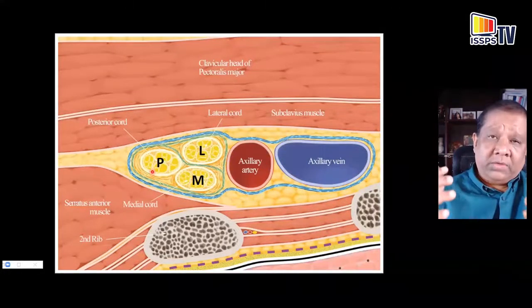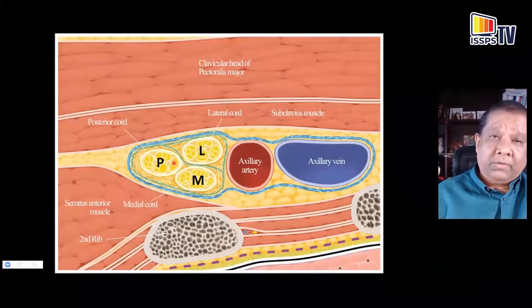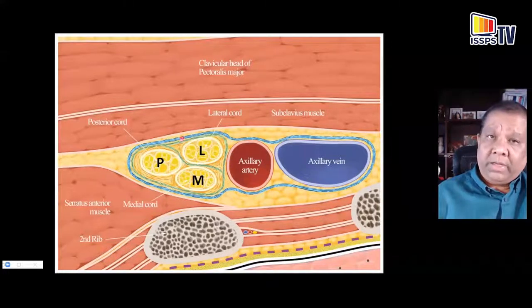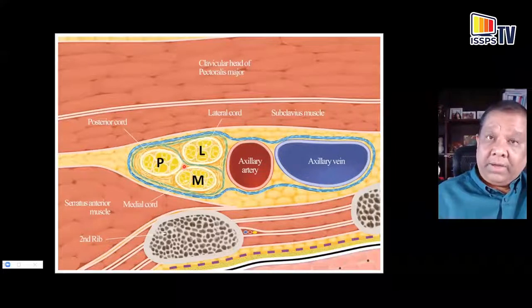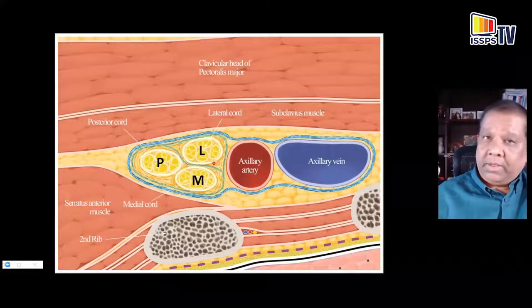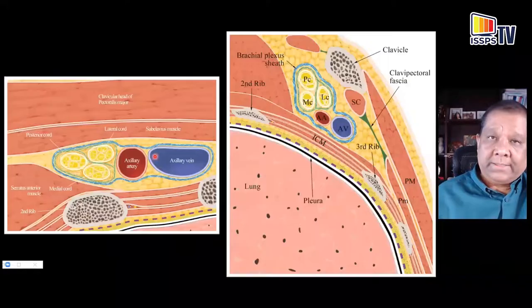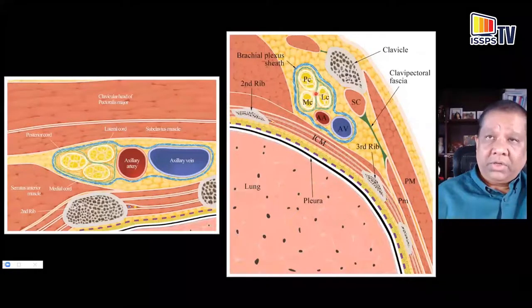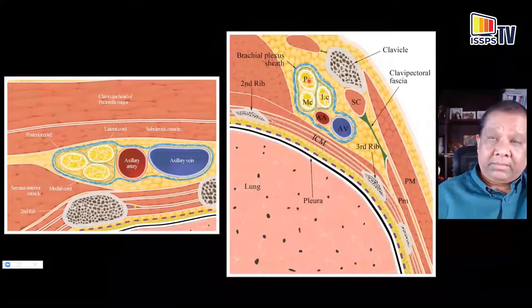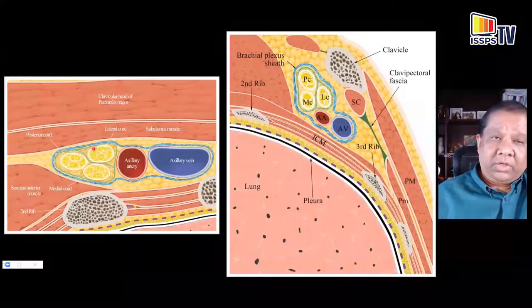Having the three cords clustered so closely together in the costoclavicular space means that placing a needle between these cords gives a high success rate of blocking all three, and a catheter placed there would ideally cover all three cords with relatively small volumes of local anesthetic. That is the fundamental basis of the costoclavicular brachial plexus block. In sagittal and transverse views you can see the Phrygian cap arrangement of the lateral, medial, and posterior cords.